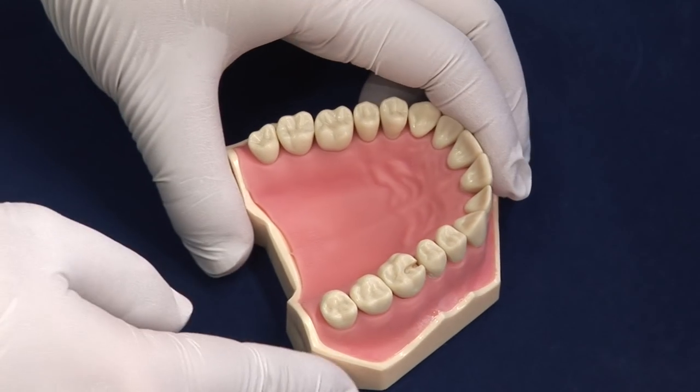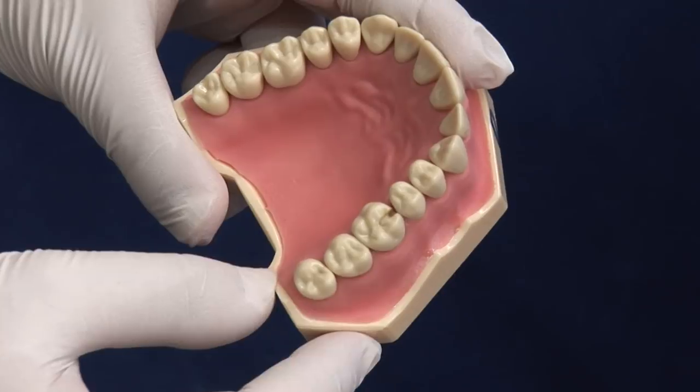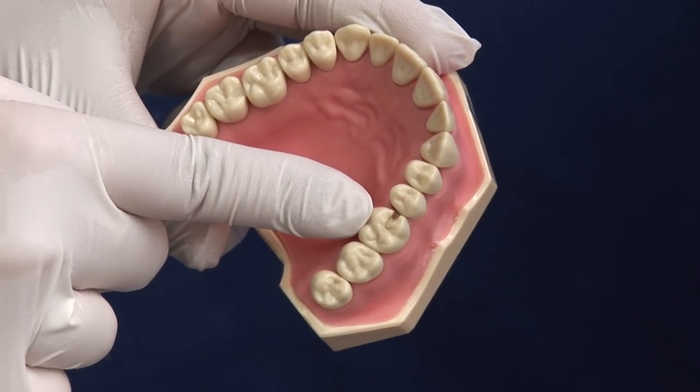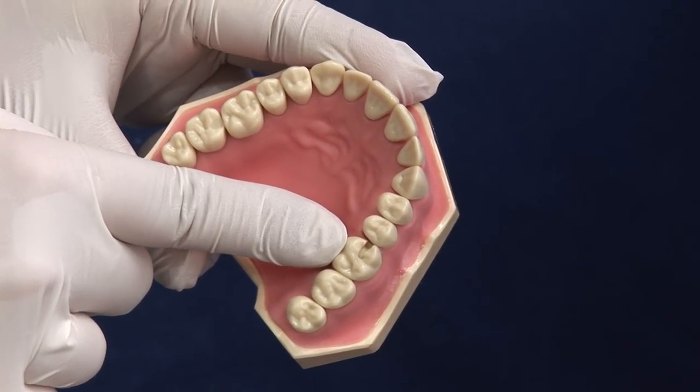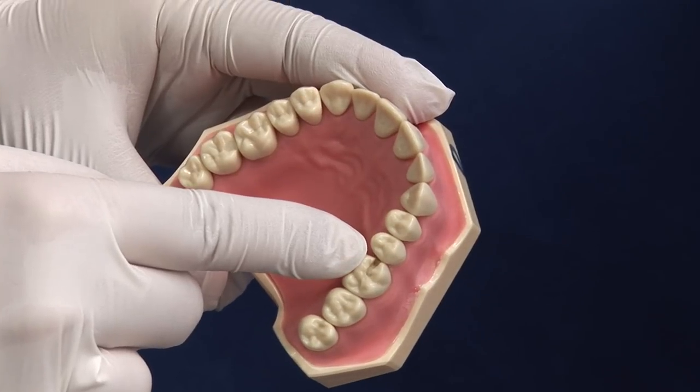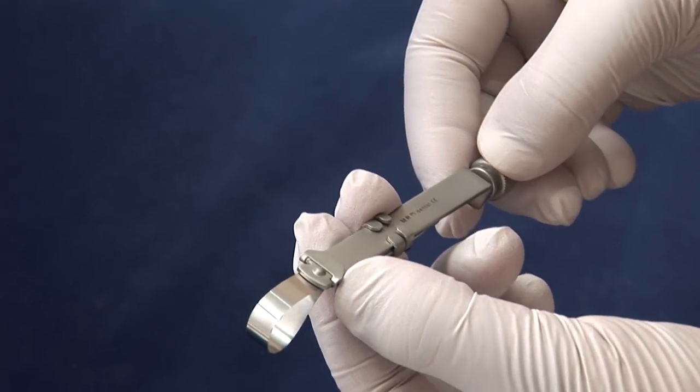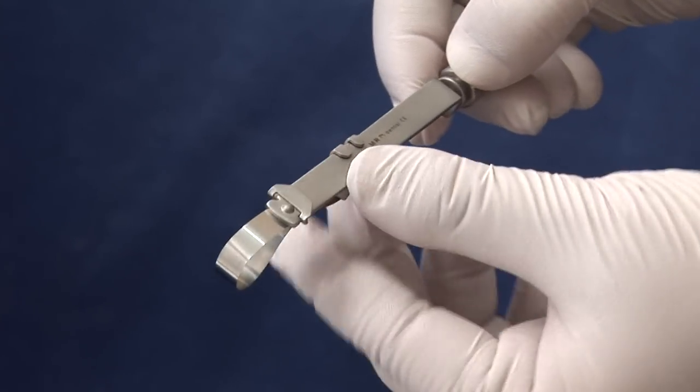This jaw will be used for the purpose of this demonstration. The matrix band will go around the two six, which already has a cavity prepared in it. The latch should be locked into the slot facing gingivally.